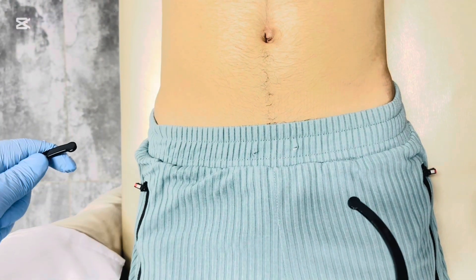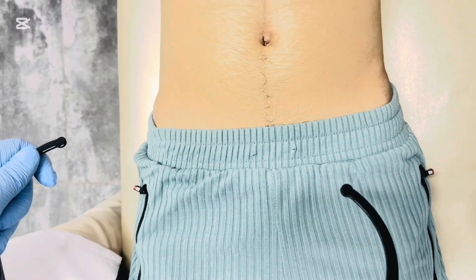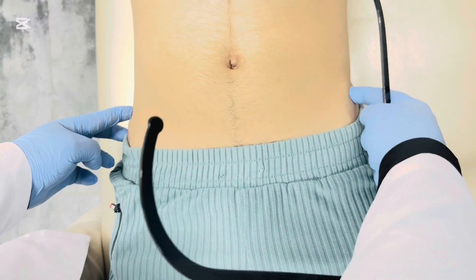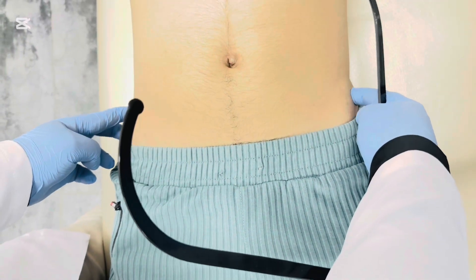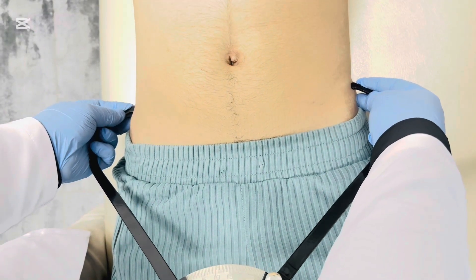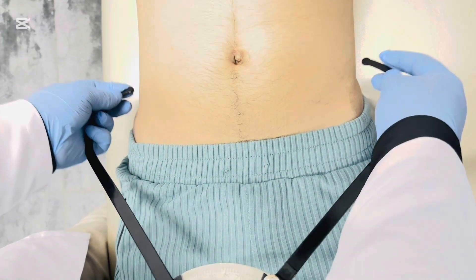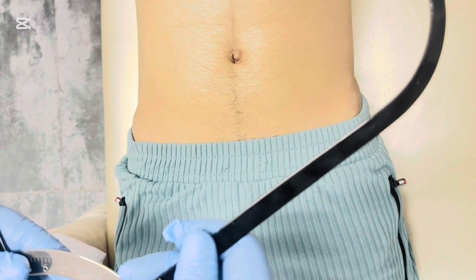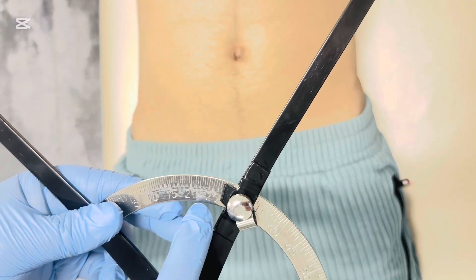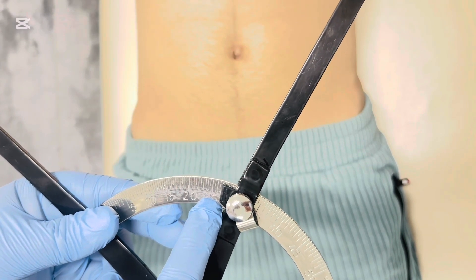Then we have the distantia cristarum, which is basically the distance between the two iliac crests on both sides. We place the pelvimeter like this on the iliac crests, and its normal value is from 28 to 29 centimeters — here you can appreciate 28 centimeters.